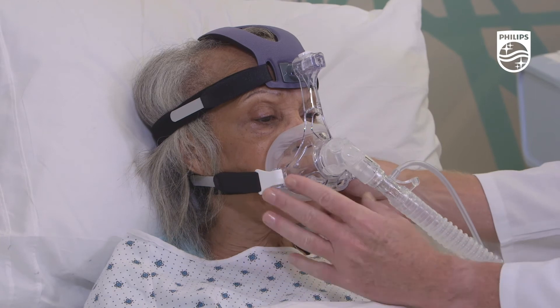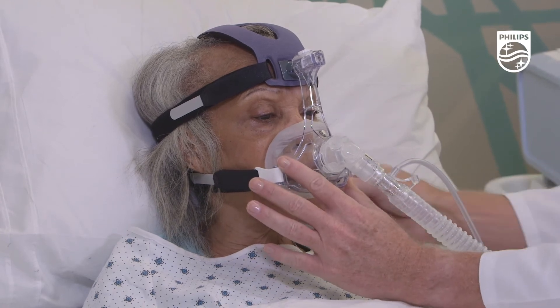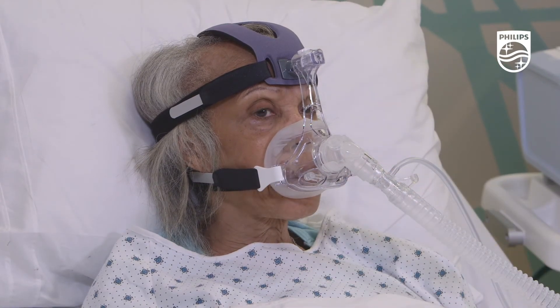Reassess the lower strap tension following the adjustment of the frame slider, along with the mask angle, mask leak rate and position.